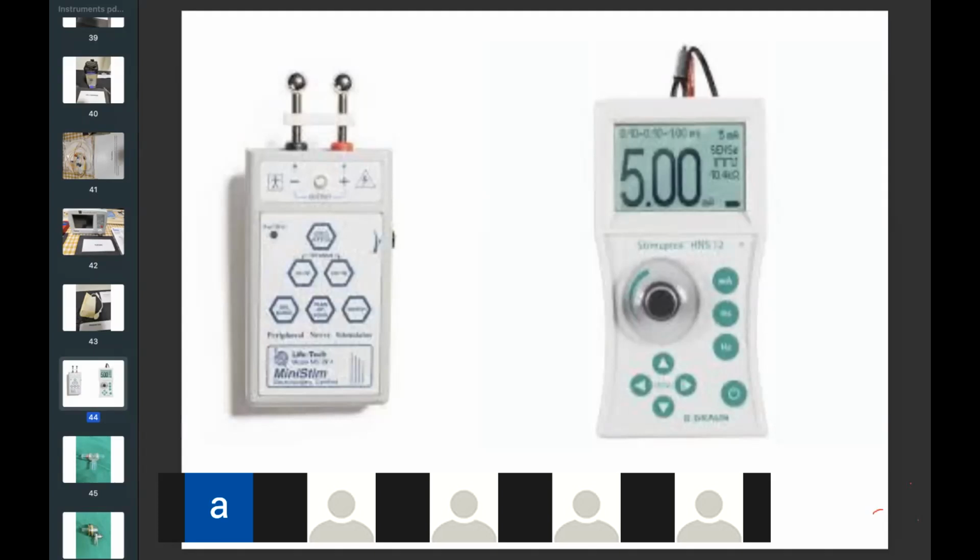So in case of the ulnar nerve, we give 40 to 60 milliampere of current. And we look for the monophasic square wave, which is displayed on PNS. We can also look for the muscle contraction visually, and we can also palpate it.